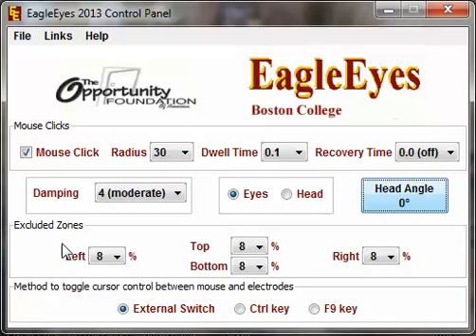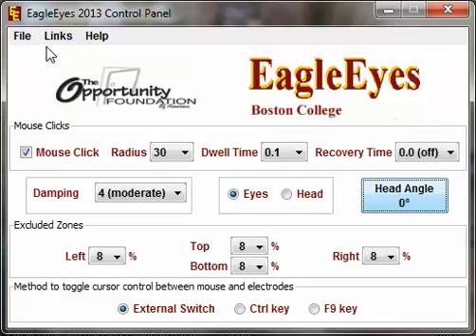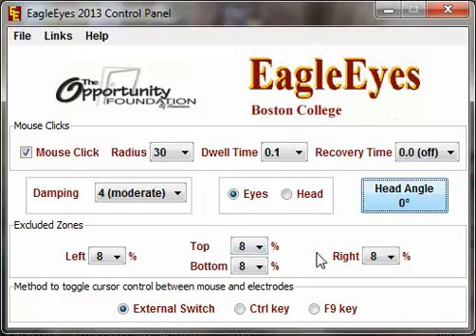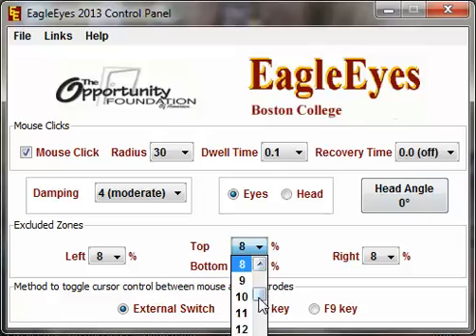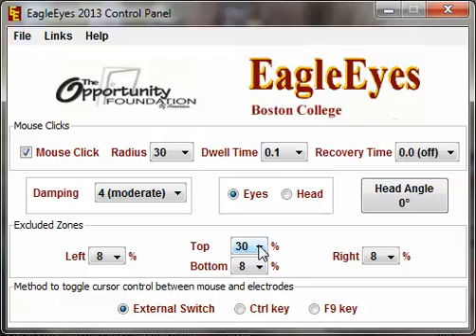The excluded zones are margins that keep the cursor from exiting a defined area. For example, we don't want the user accessing file menus while using the system, so we can set excluded zones so the cursor will not leave a certain area. Traditionally about 8% will work for any full-screen games — that's usually enough to keep the cursor out of the bottom and top menus on your screen. If you're using a smaller window, you may need to set it to 20 or 30% to properly contain the cursor.